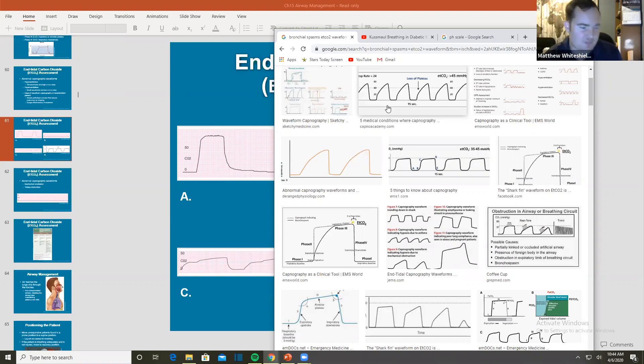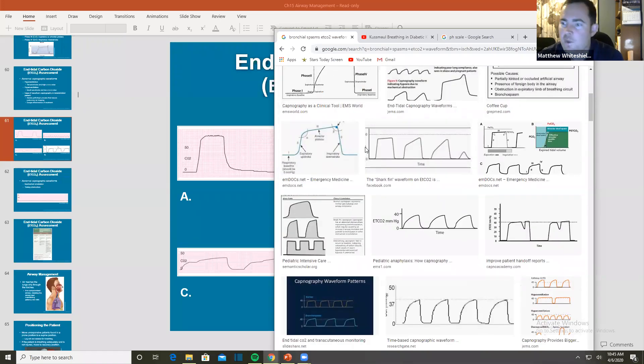This is going to play a very crucial role in our treatment. Let me explain myself. There is something out there called cardiac wheeze. You will come across patients that have no history of asthma, no history of anaphylaxis or allergic reactions that have a cardiac history, high blood pressure. They might even have history of heart failure, but you hear wheezing. And then when you look at the end-tidal capnography waveform, you will not see shark finning. But you're like, I know I'm hearing wheezing. This is considered a cardiac wheeze. If you hear cardiac wheezes, we do not treat it as wheezing. You can see how easily this can be misdiagnosed. I've been there, I've done it. I've treated patients inappropriately because I heard wheezing and I jumped on it.